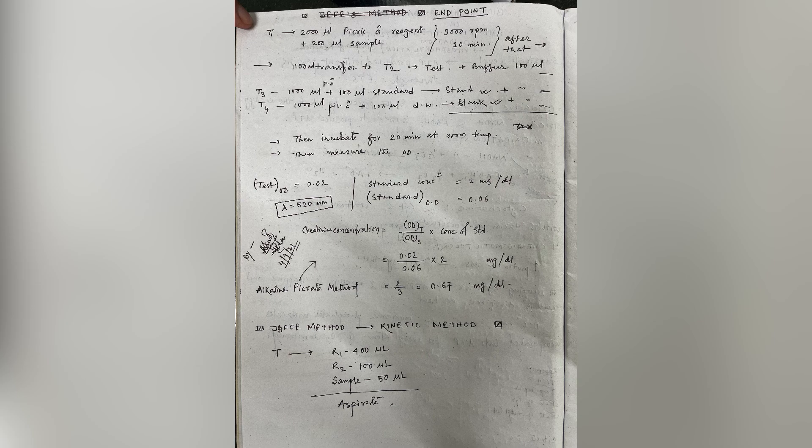The standard is made using 1000 microliters of picric acid along with 100 microliters of the standard. The blank is made using 1000 microliters of picric acid with 100 microliters of distilled water. The calculations and results of a demo experiment done in class are given.